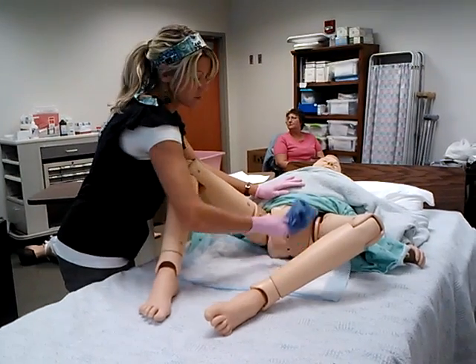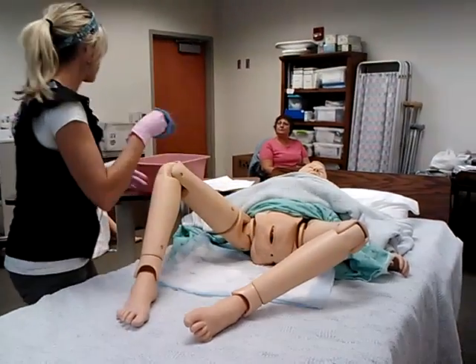So, you're not passing off this part. You just have to pass off that you did do pericare. Okay.